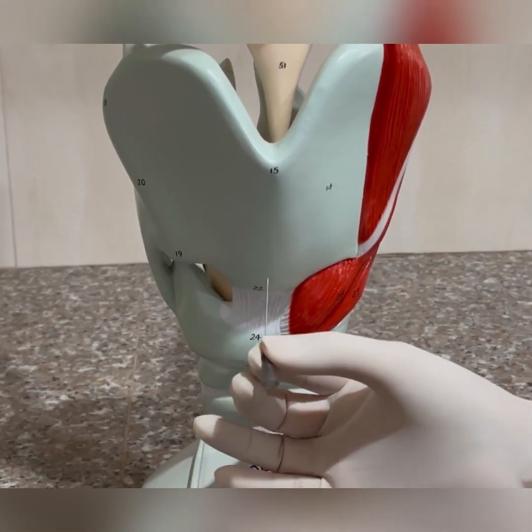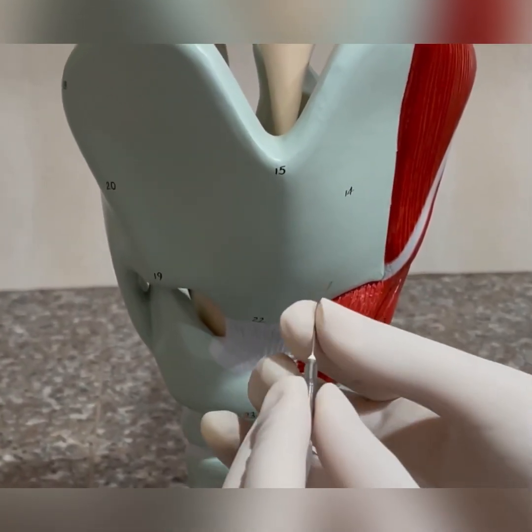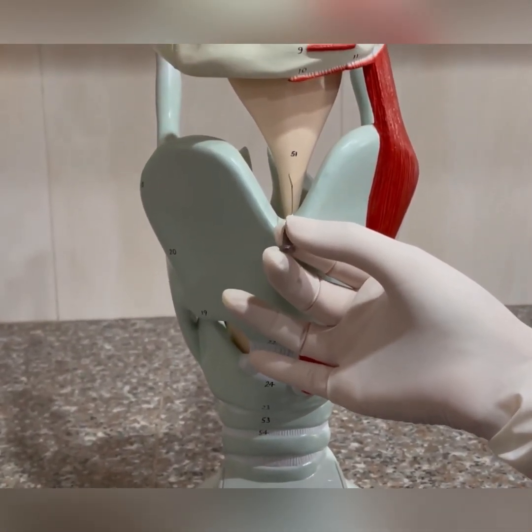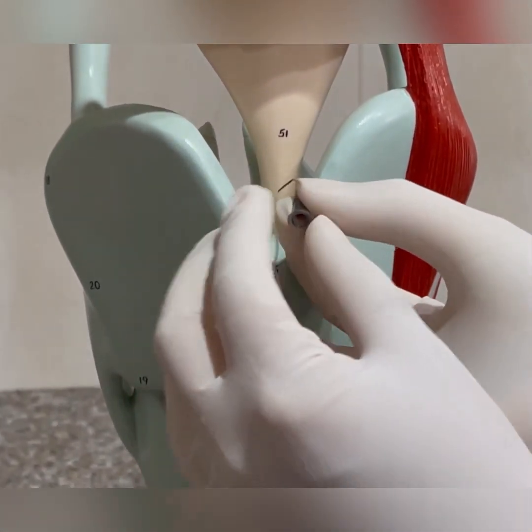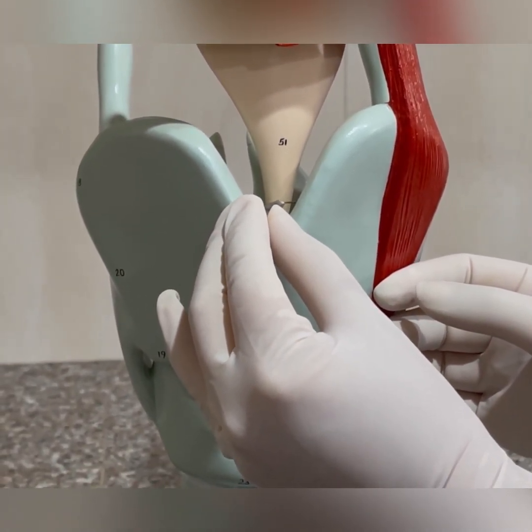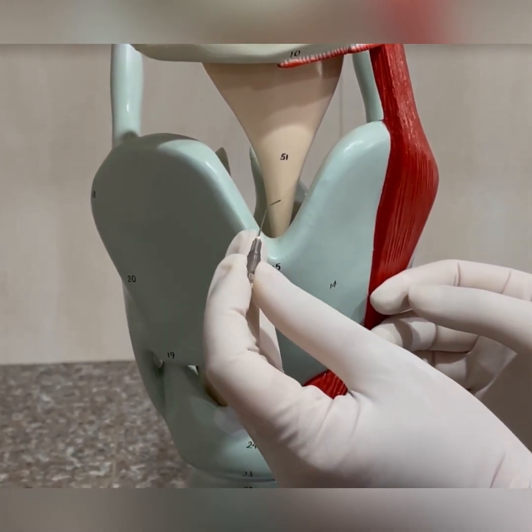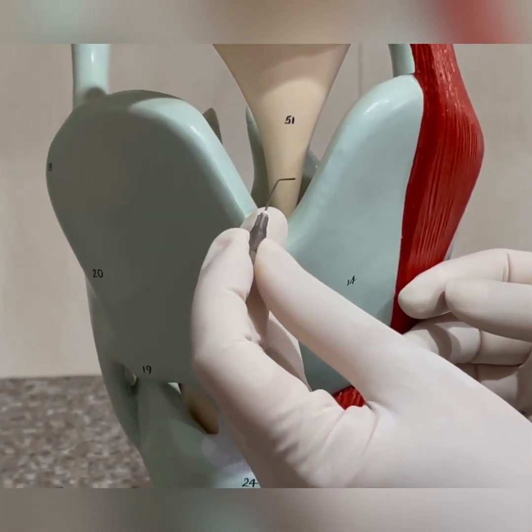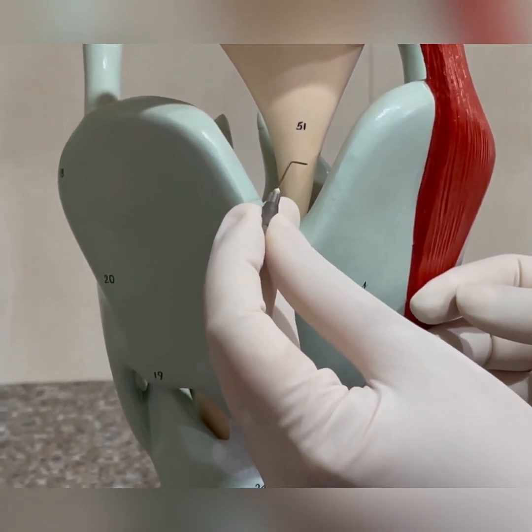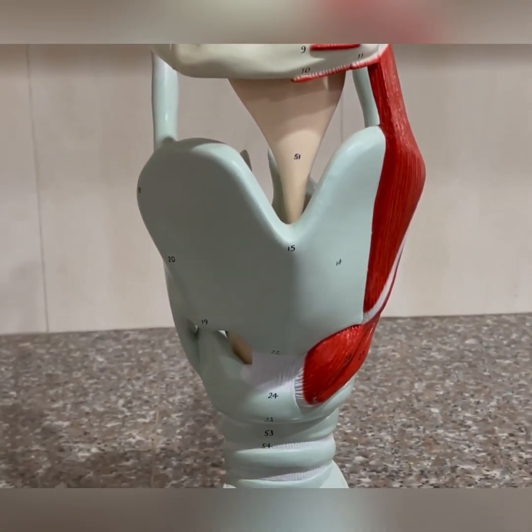If we are trying to do a thyrohyoid injection, we can have a double bend on our needle — typically a 26 gauge tip — going through the thyrohyoid membrane, through the petiole of the epiglottis in a downward direction, injecting through the supraglottic surface into the paraglottic space. Since you're piercing the petiole of the epiglottis, you may get a little bleeding. The needle tip is easiest to see with the thyrohyoid technique and most difficult to see with the cricothyroid route.